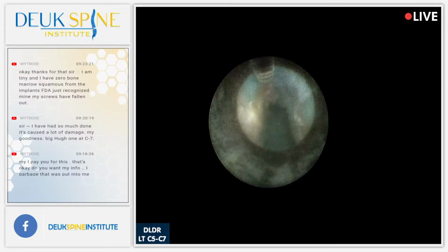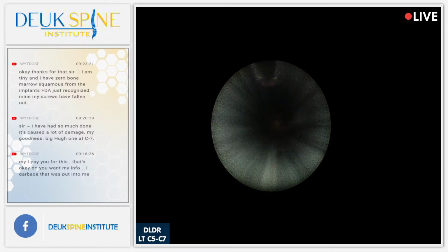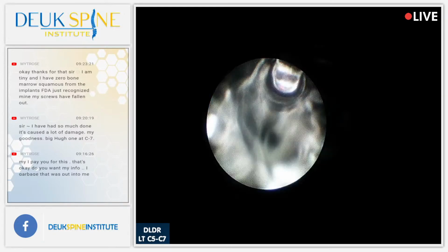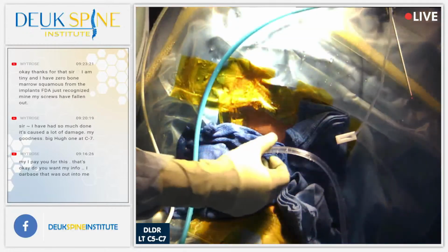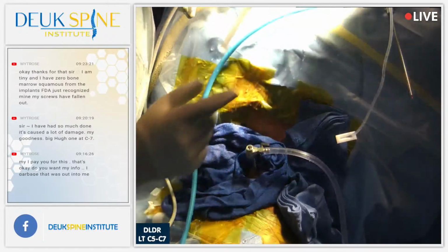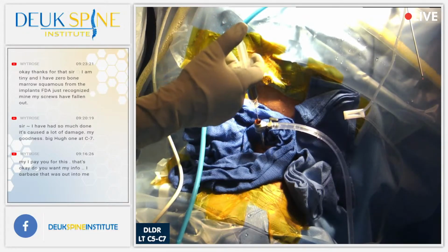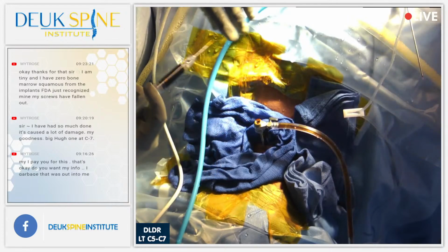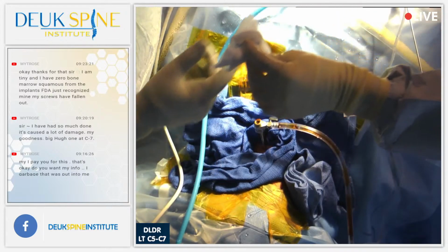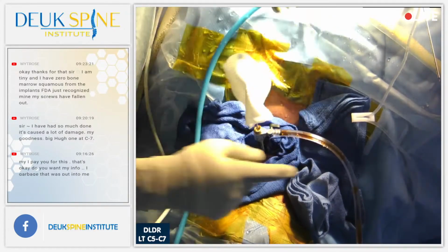All right, we're pretty much done here. I don't see any more herniations. We're done, okay? Woo, my hand is freezing. You guys did an awesome job. How do we get such nice cold irrigation? Cold irrigation is important for the laser. All right, that's betadine. What is betadine? It's an antiseptic. We use it to... how come my suction is off?